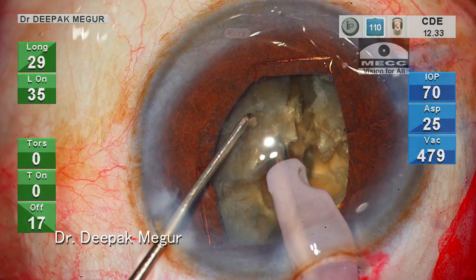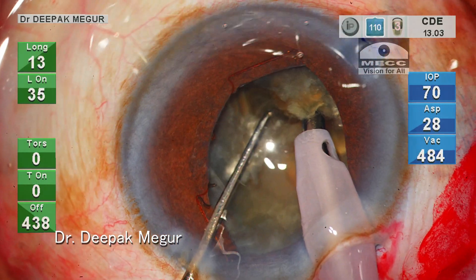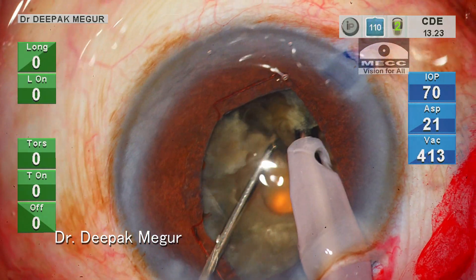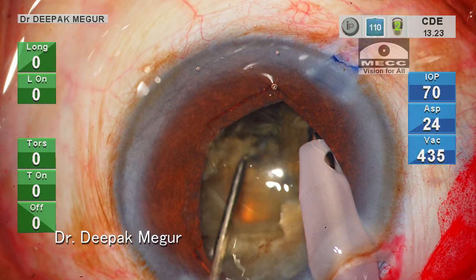Similar maneuver: bury, chop, and then laterally separate. My right hand is steady. My left hand with the chopper is being placed at progressively deeper planes to achieve complete division. Being slow, steady, and persistent is the key.